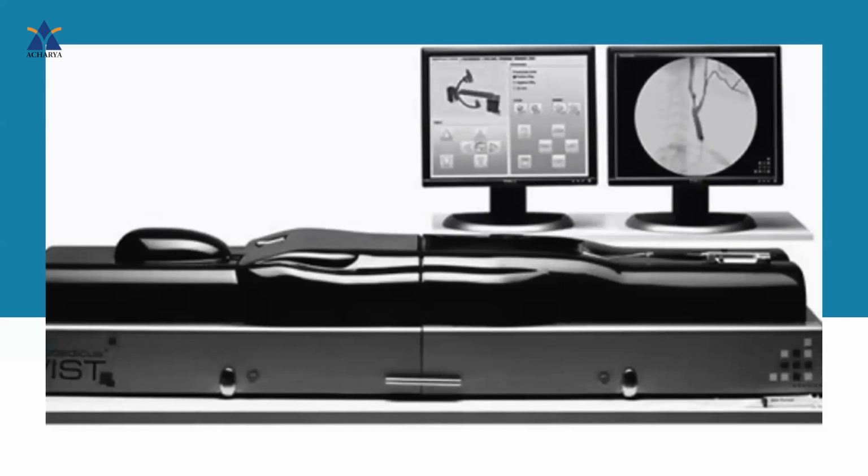You have your standard desktop, and along with this, software that contains a 3D representation of the human arterial system. This can be coupled with a haptic module utilizing a force feedback system.